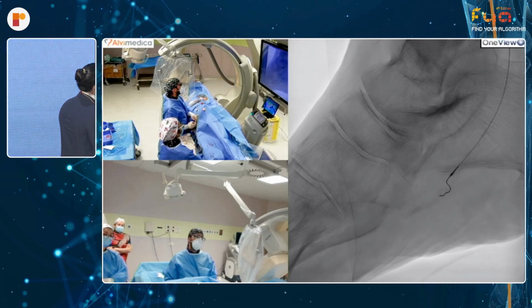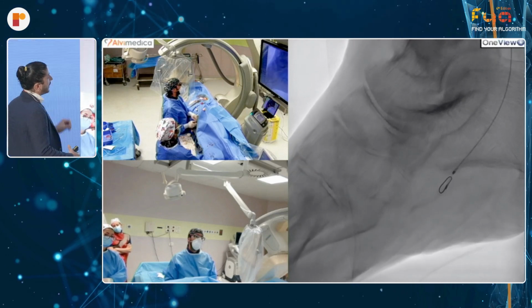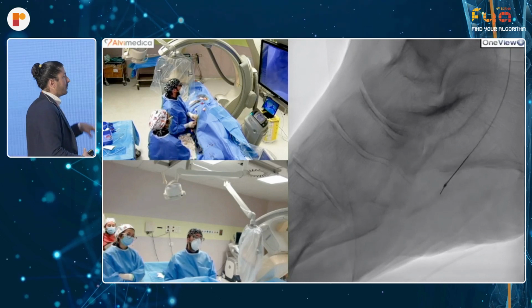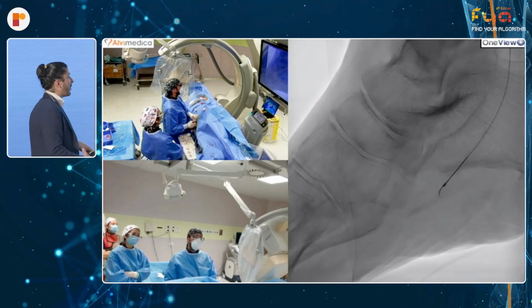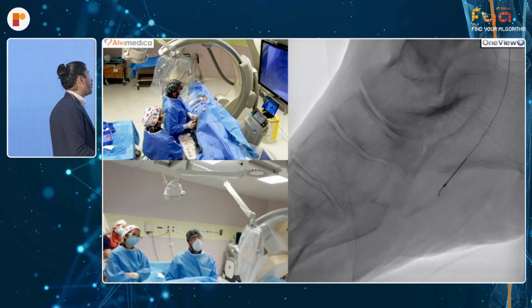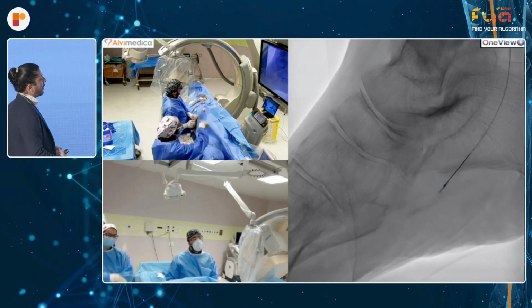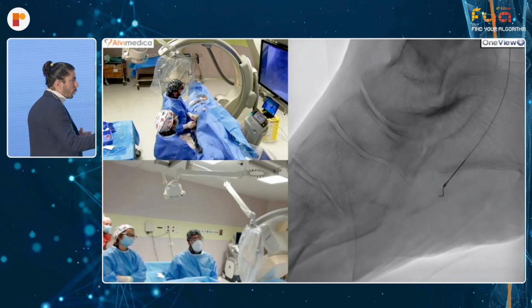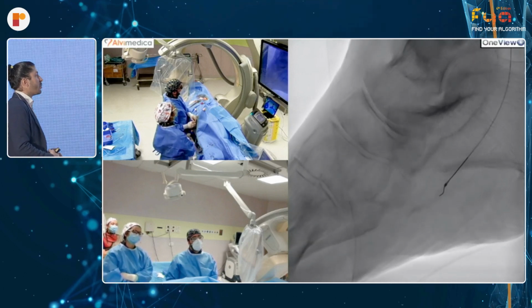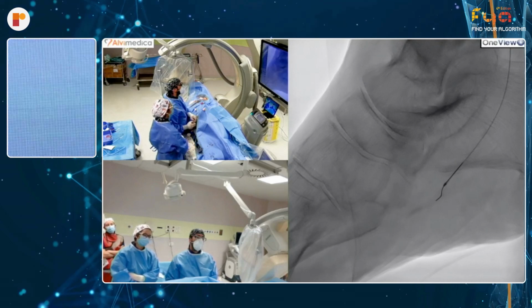So again, no heavy calcified arteries, just spot calcifications in the median part and in the distal part of the lateral plantar, but the device performed pretty well, arrived without problem till the forefoot or the midfoot, but the wire, or myself, I failed to re-enter in what I was able to see from the beginning, a very poor distal landing zone artery that was not at this point, but was here.